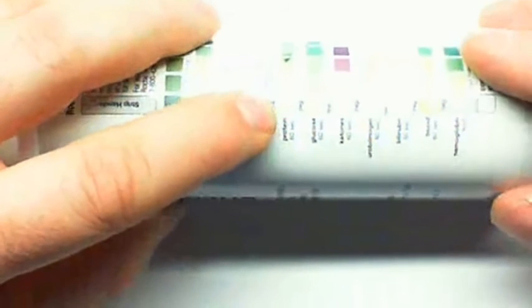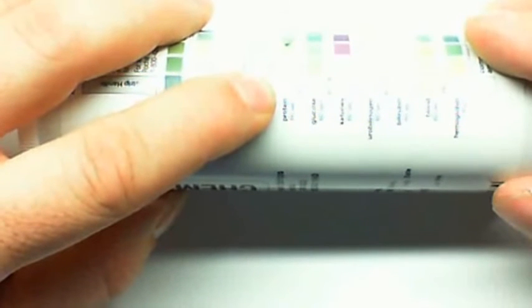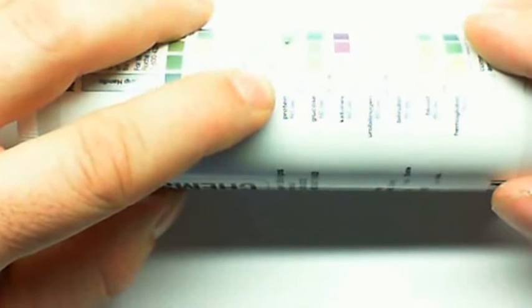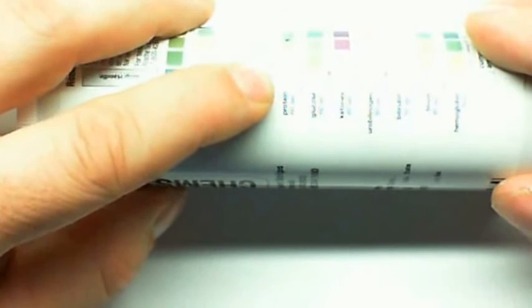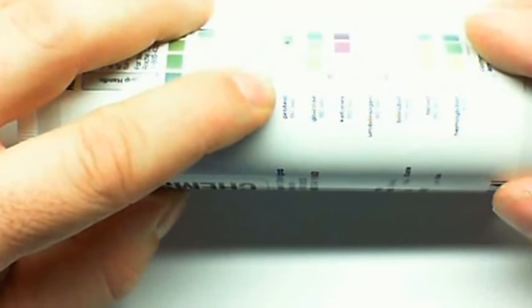The next one is protein, and you can get transient increases in protein in your urine. That might result from standing on your feet too long, which will increase your blood pressure around your kidneys, exercise, pregnancy, or if you've had a large protein meal like a steak or hamburger. Then protein can naturally be in your urine. Most of the time there shouldn't be any protein in your urine because the glomerular filtration membrane usually filters everything smaller than a protein, or at least the bigger proteins.